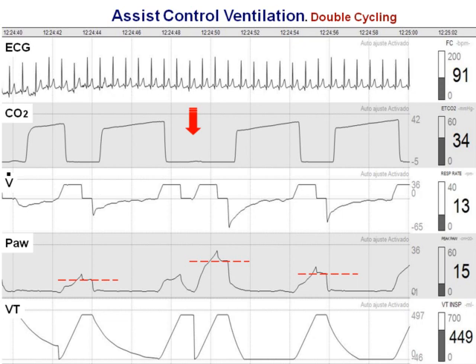And you will see how that happened. What's the problem here? Maybe the alarm limit setting in that case is very high, perhaps to avoid the alarm going off all the time, and perhaps this is a mistake. But at the bedside, we need to find out all these types and interpret all these tracings.